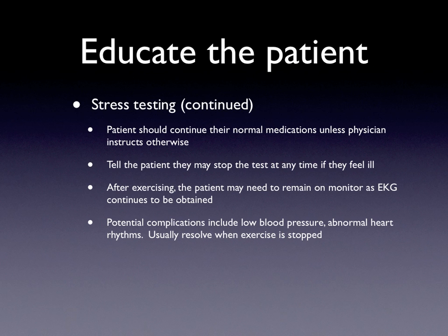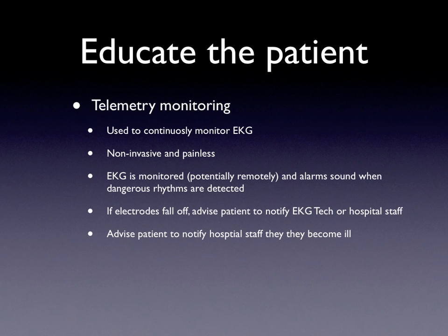The next type of EKG monitoring that you might be involved in is telemetry monitoring. In telemetry monitoring, we're using it to continuously monitor the EKG, usually in an inpatient setting. It's non-invasive and painless, of course, all EKG is. The EKG is monitored potentially remotely. We've talked about how the VA facility in Tomah, Wisconsin is monitored from a facility in Minneapolis. And alarms can sound when dangerous rhythms are detected.